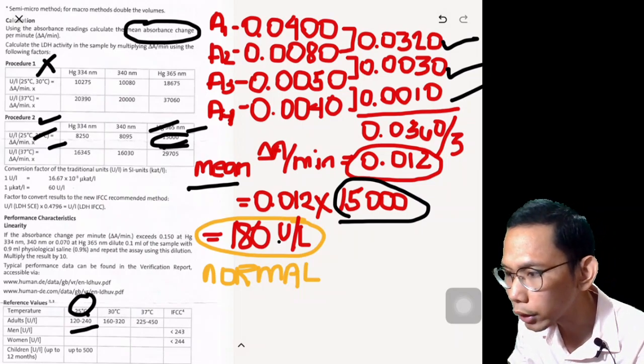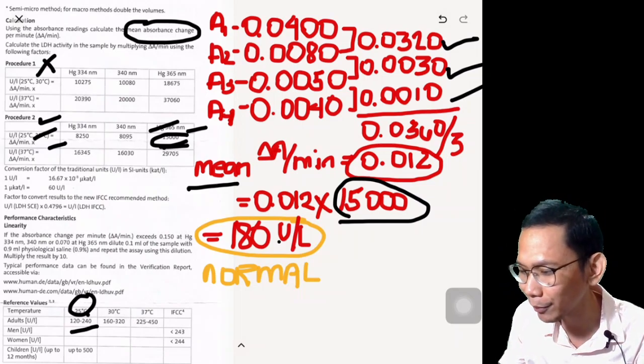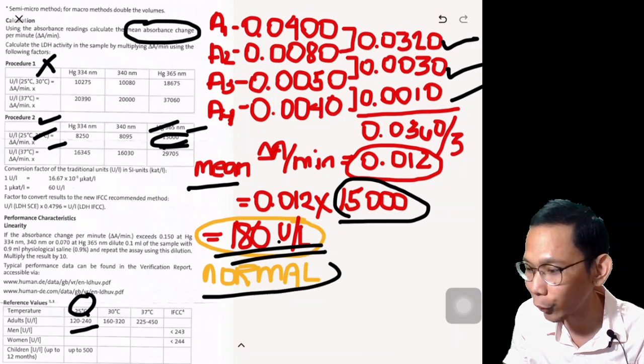It's not microliter. What's this? I forgot how do you say it's UL. UL na lang guys, I forget microliter. It's not microliter, units per liter. I'll just check on that, okay? So our value was 180 UL. So this is, our patient is normal.